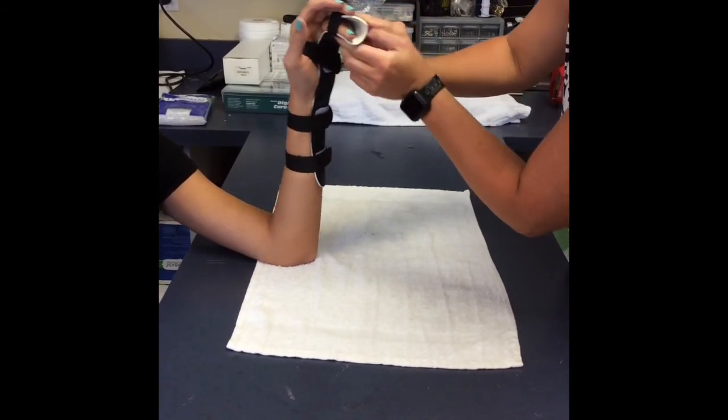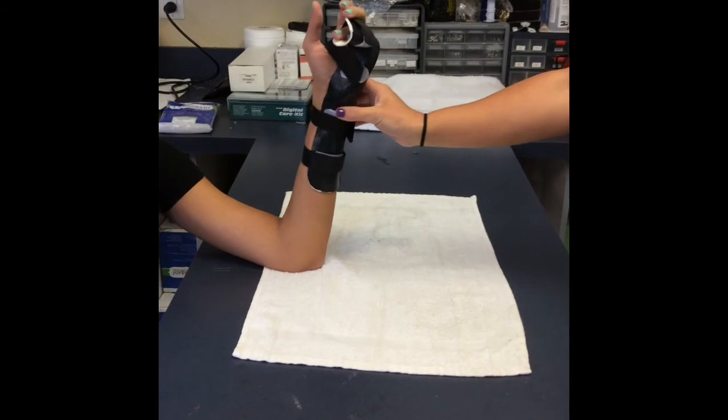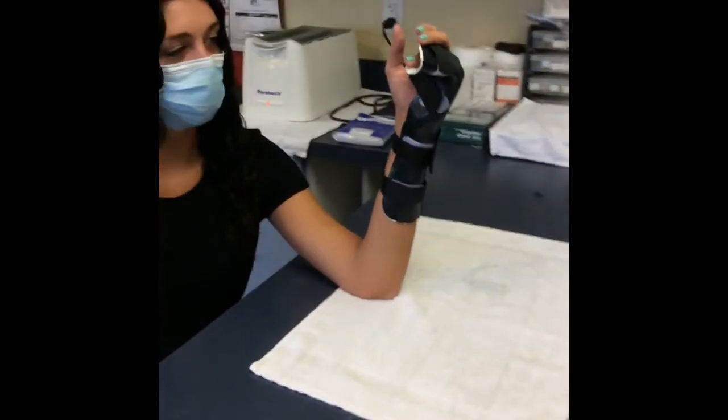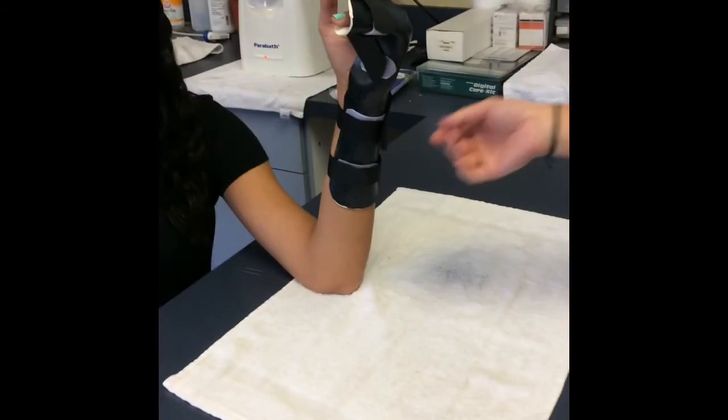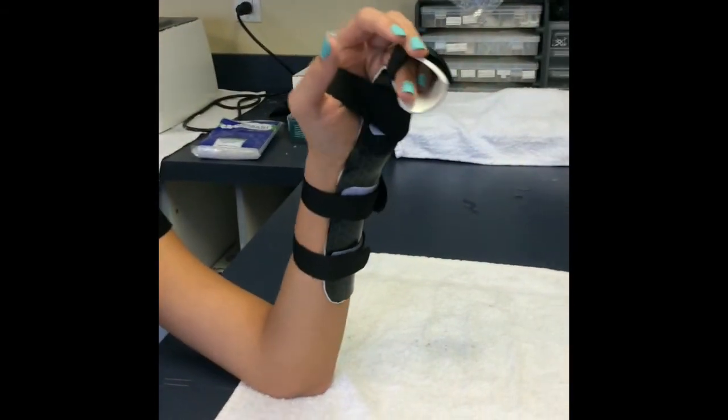When finished, ensure that the patient can freely move the thumb, index finger, and long finger. There are no areas bothering the patient, your edges are all smooth, and the proximal part of the orthosis is flared out to ensure comfort.